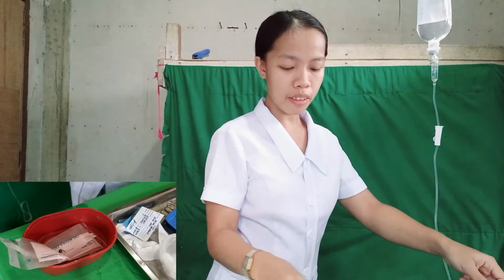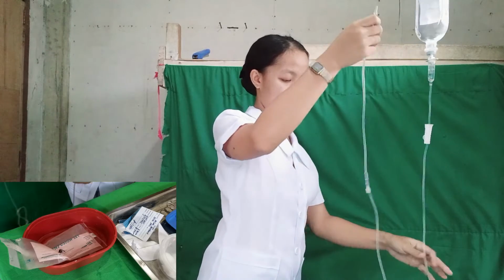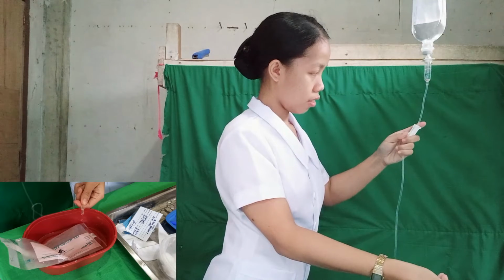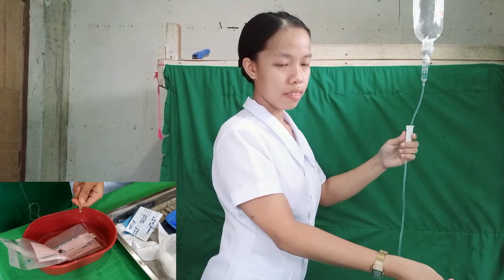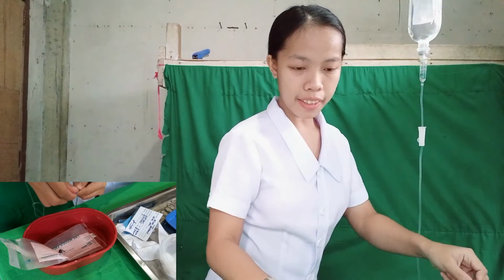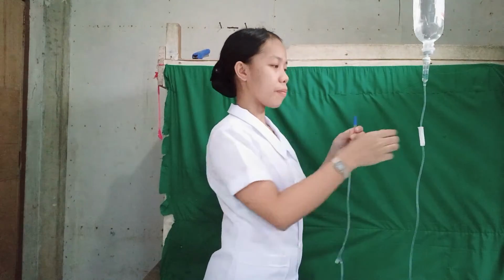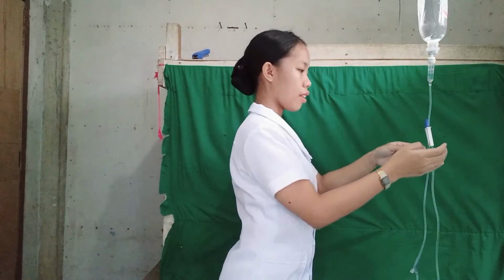In doing that, we will make use of our kidney basin. Then after doing this, we will close the clamp and recap the end of the tubing to maintain the sterility of the setup. We are now done preparing our IV solution.